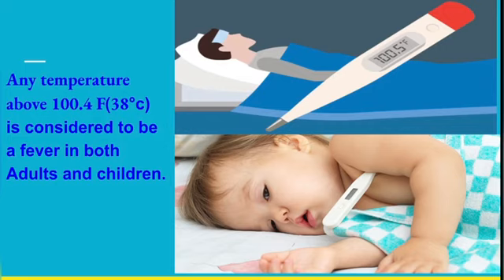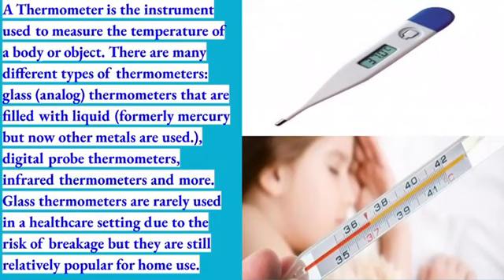Any temperature above 100.4 degrees Fahrenheit, which is equivalent to 38 degrees Celsius, is considered to be a fever in both adults and children. A thermometer is the instrument used to measure the temperature of a body or object. There are many different types of thermometers.